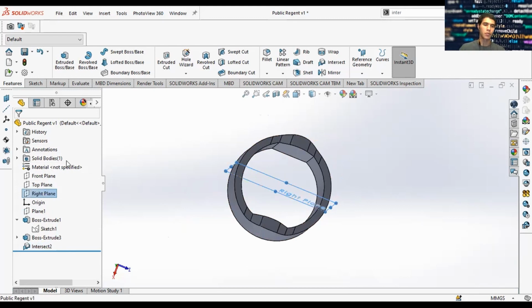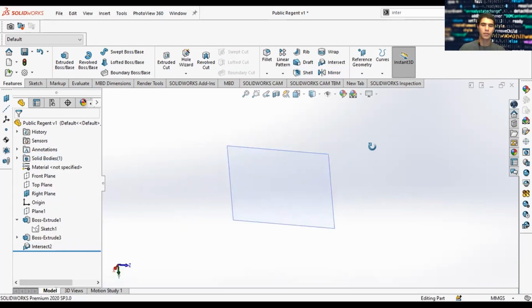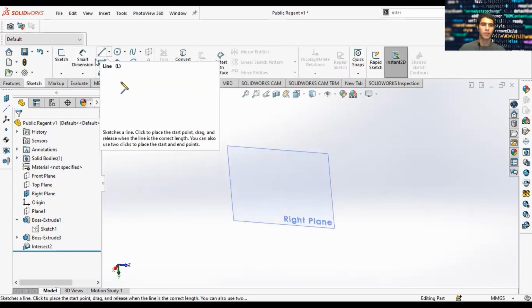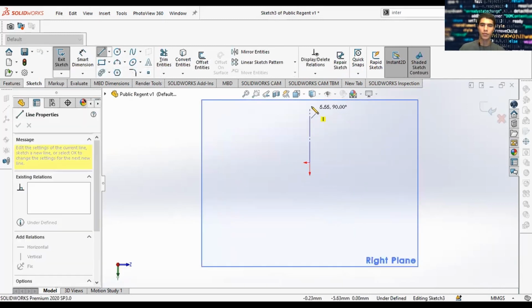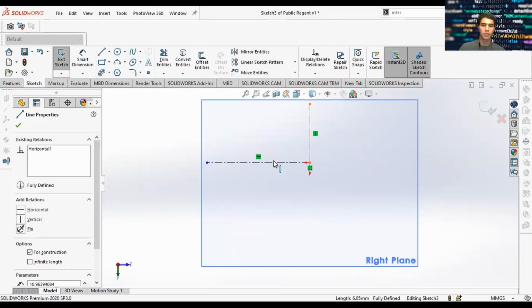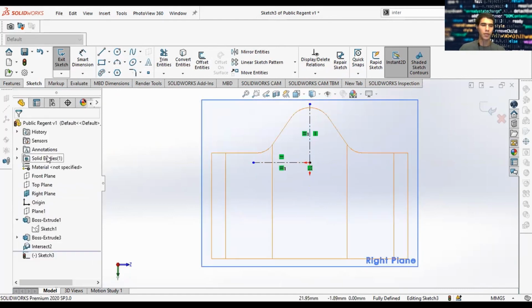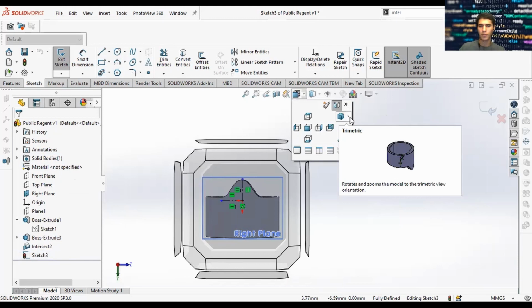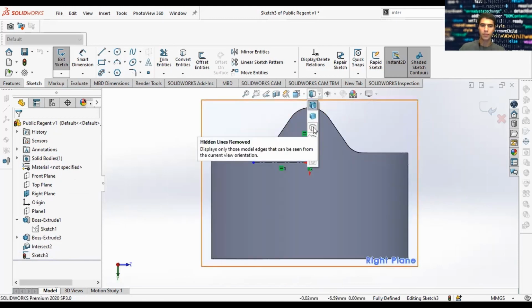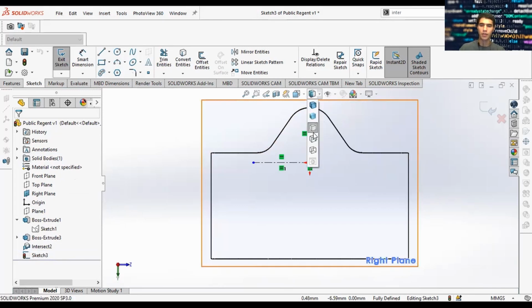Which plane would that be? It would be the right plane. So let's put the right plane to show, and let's hide our solid body. So now we're hiding our solid body, and let's sketch on our right plane. So let's put some reference lines. Set them equal. So we'll put an equal relationship. And then we can bring back our body, and we'll make it see-through. So now our body's see-through because it's only solid lines. And also make hidden lines visible.